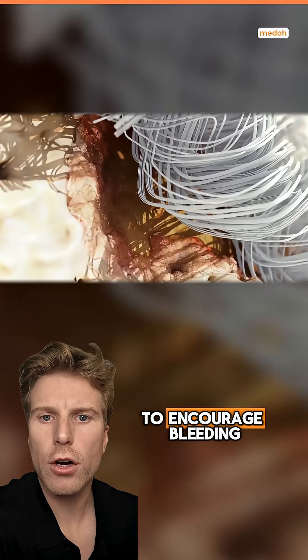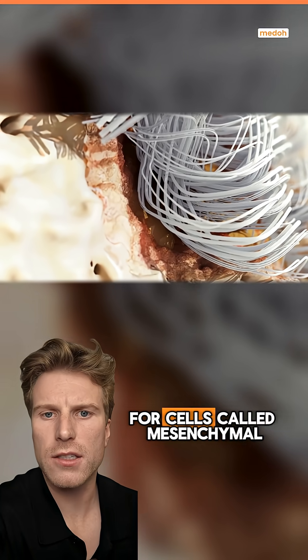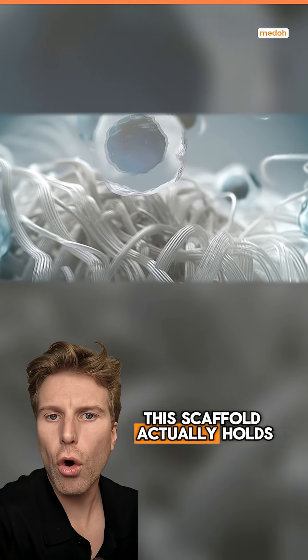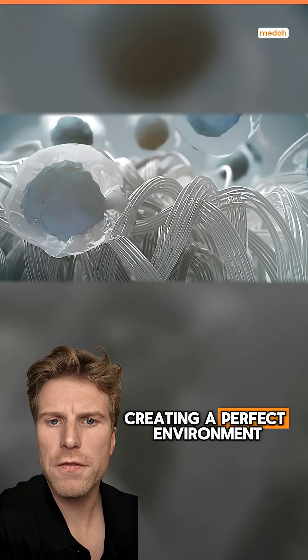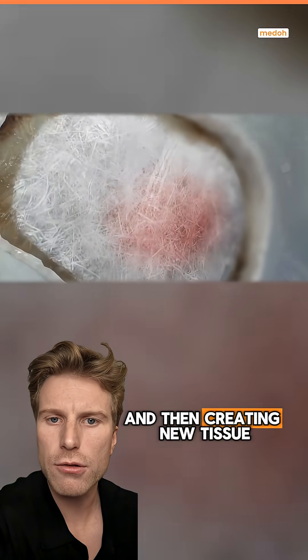Small holes are usually made in the bone to encourage bleeding, and the 3D scaffold acts like a cell-catching net for cells called mesenchymal stem cells. Over the next few weeks, this scaffold holds these cells in place, creating a perfect environment and framework for these cells to start multiplying and then creating new tissue.